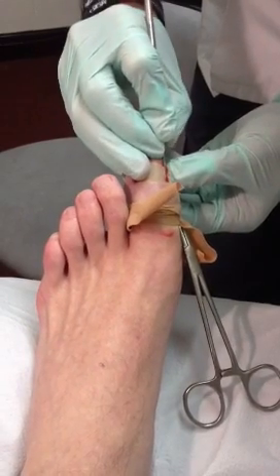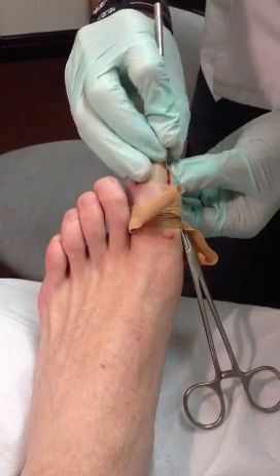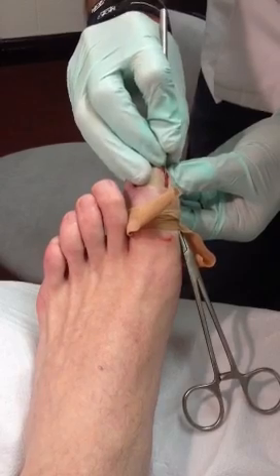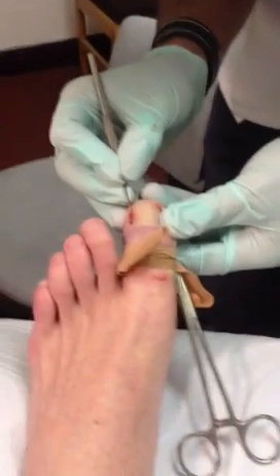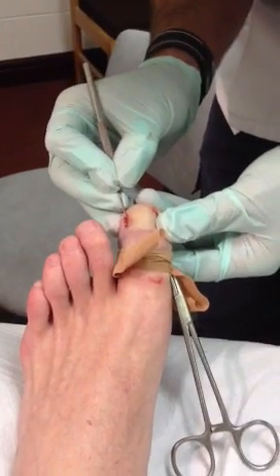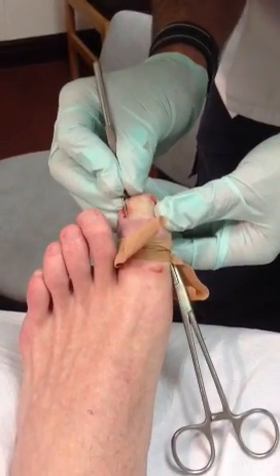A bit thicker than it should be, this nail. Blood — that's what we want. There'll be a little... yeah, that's right, that's good, that's good.